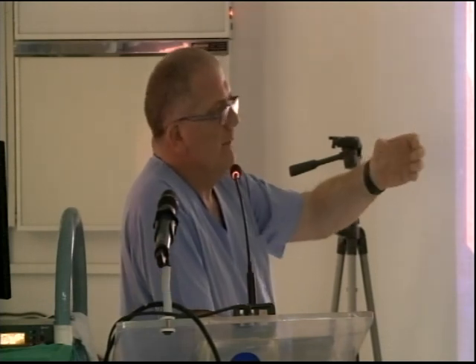And when I went to take this polyp off, I looked at the polyp, and the stalk went like this. Pulsating. How many of you would actually take time to watch the stalk? So now you know it's pulsating. What are you going to do?